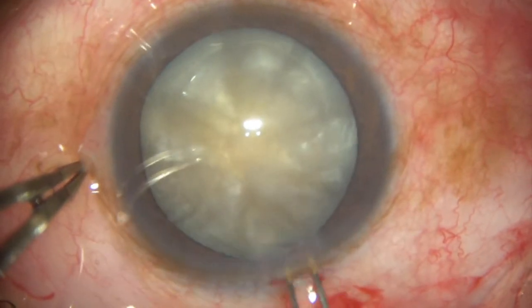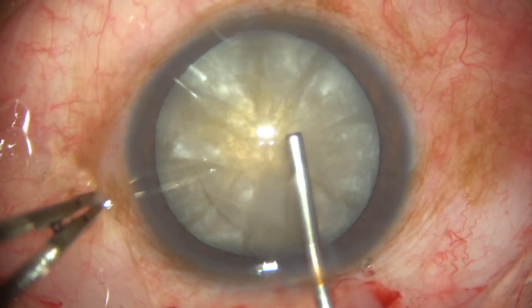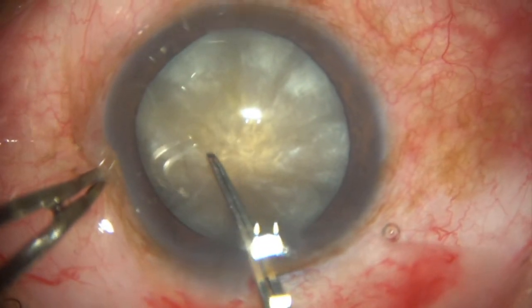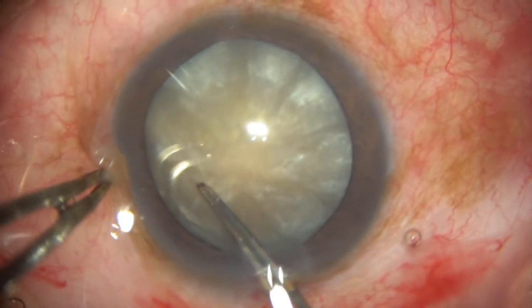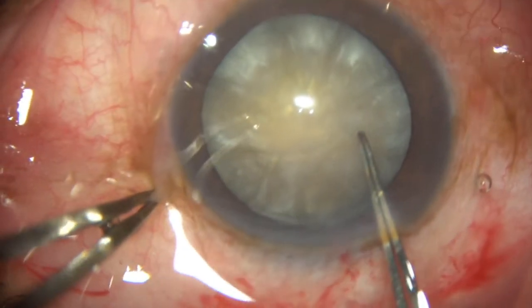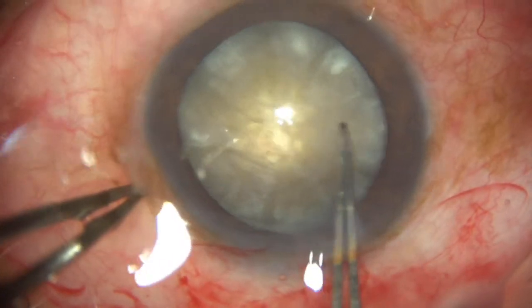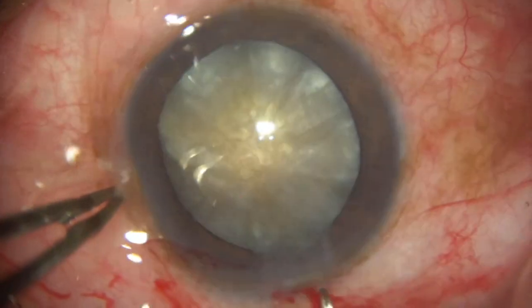As and when the liquefied cortex precludes the view of the continuing rhexis, one needs to refill with the OVD to disperse the liquefied cortex out of view. And what I do to enable this is to do a gentle decompression also. This technique enables a safe, continuous, curvilinear capsulorhexis, making these challenges seem routine without any extra procedure or expense.